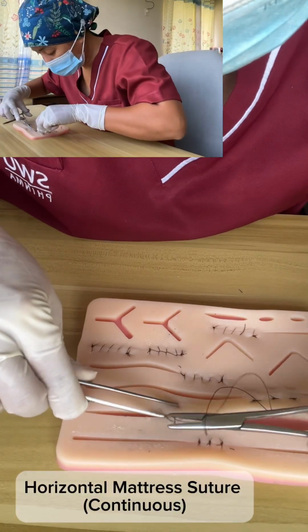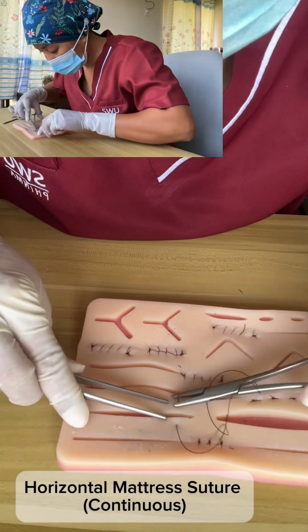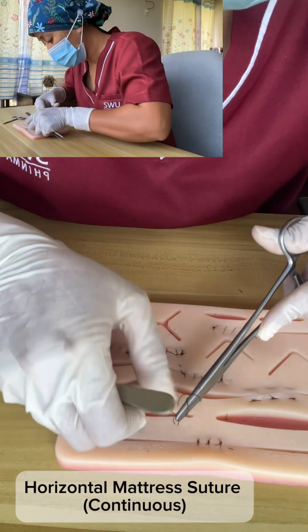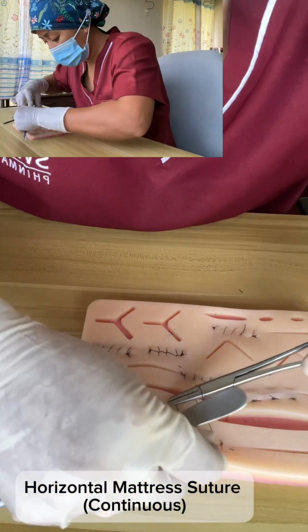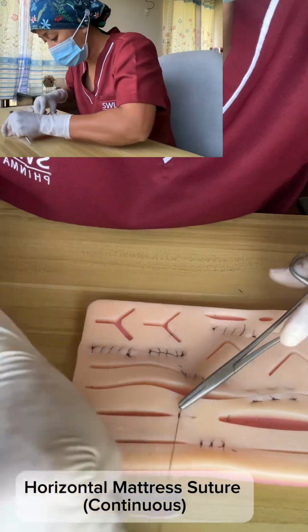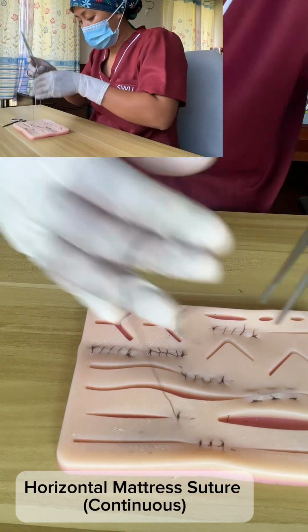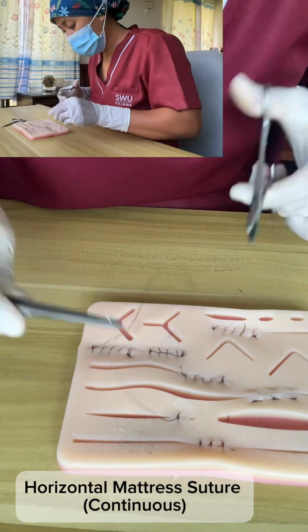Now moving on to horizontal mattress suture, which I do here in continuous. The continuous horizontal mattress can act as an appositional pattern, but in practice, it often causes eversion of the wound edges. It is commonly used in skin, fascia, and areas under tension.